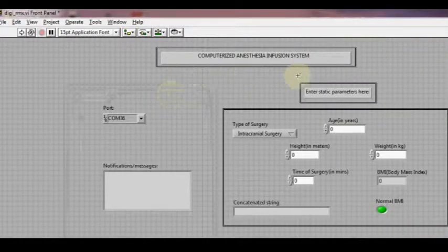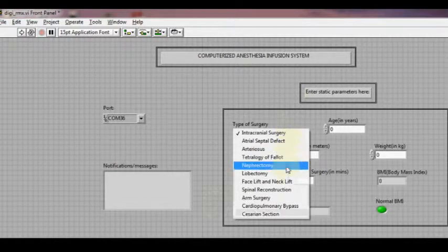Now let us see the overall working of a prototype. This is the front panel of our system. Initially, the static parameters of the patient are entered. These include the type of surgery. Our database contains a list of 10 surgeries which are created in LabVIEW.